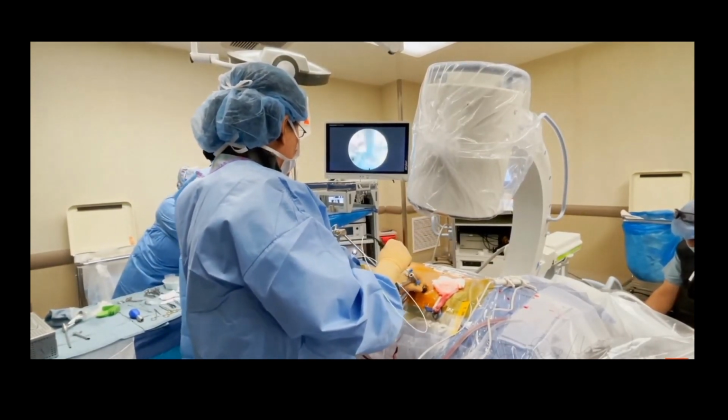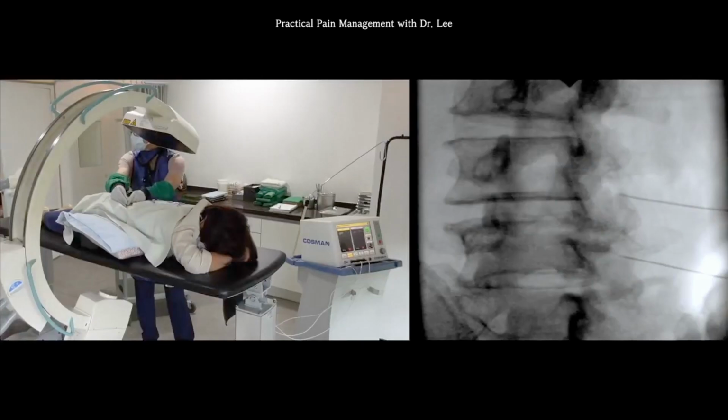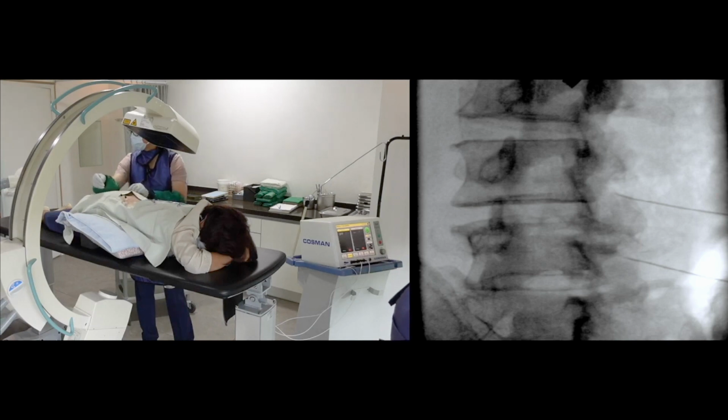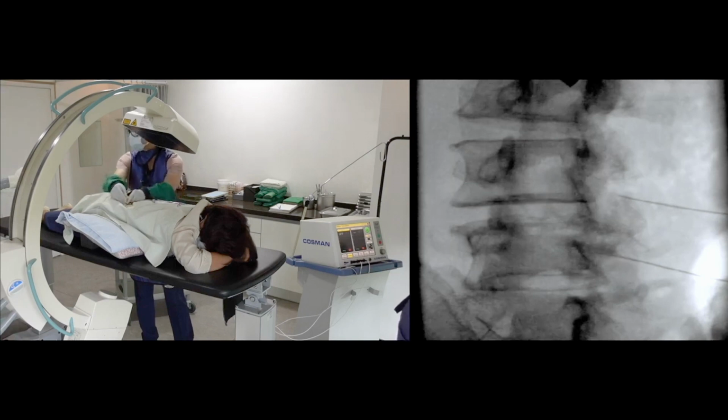In recent years, a technique known as pulsed radiofrequency treatment has emerged as a promising approach to managing both somatic and radicular spinal pain. This involves sending pulsed electrical signals to the targeted nerves or tissues, providing pain relief without the need for hospital admission.